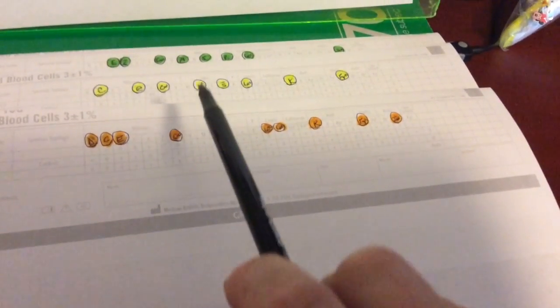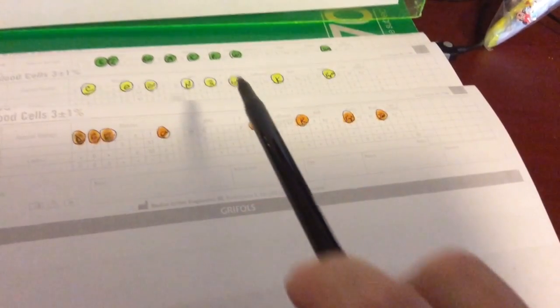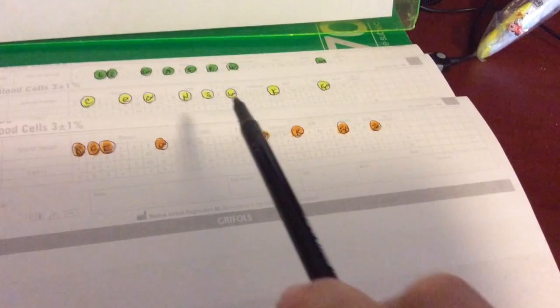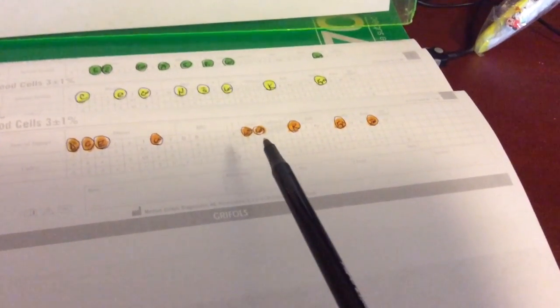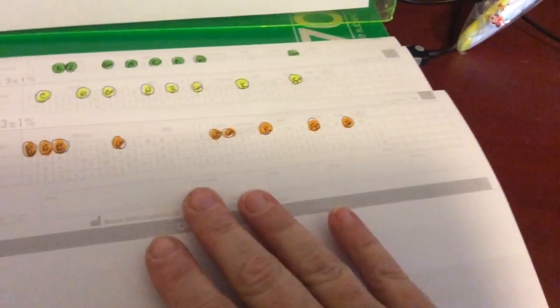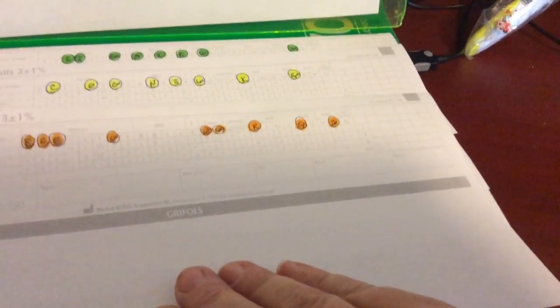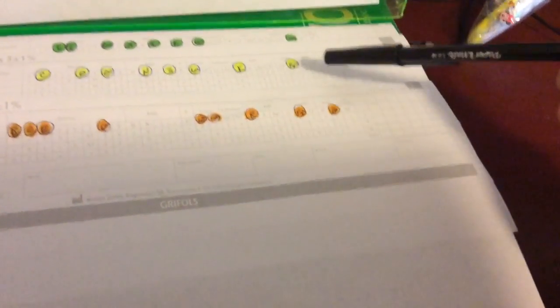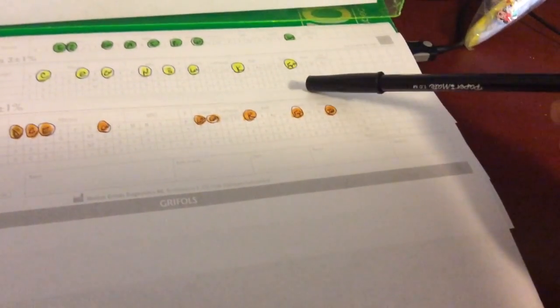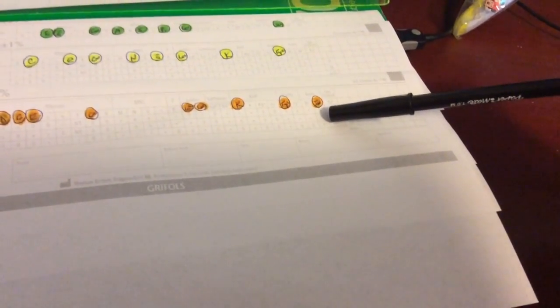Okay. M and N, big S, little s, you can see the pattern here. P1 is in the R1 serum. Then we have Lewis A in both serums. Lewis B in the R1 and the little r. This is a little off, sorry. I'll line them up a little better. Okay, so you can see again the K's then are in the R2 and the little r. Duffy A, Duffy B, JKA up in the R1, and JKB in the little r.